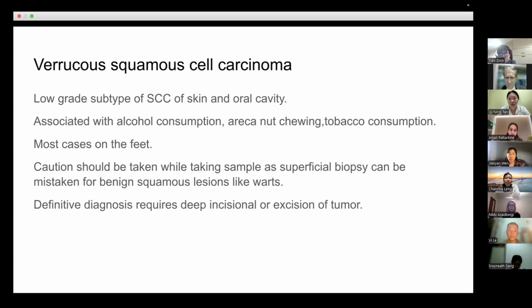Or they're thinking about a squamous cell carcinoma, and that's the type that sometimes comes with smaller biopsies. There is no way to say in a smaller biopsy. We don't have any atypia, and even the architecture is not something you can go by on small excisions. You have to see the entire tumor.